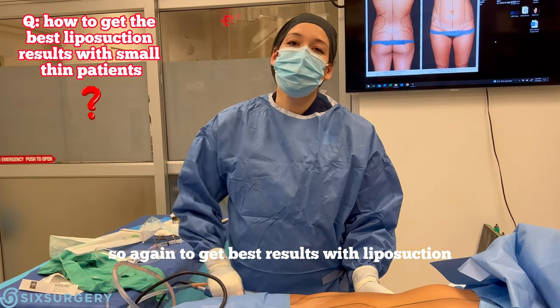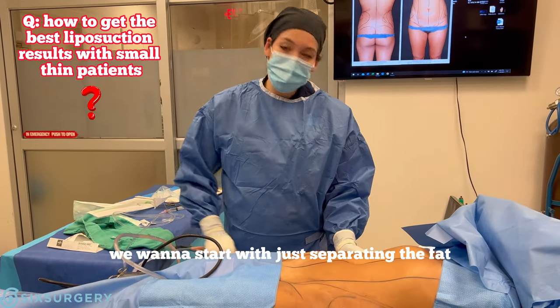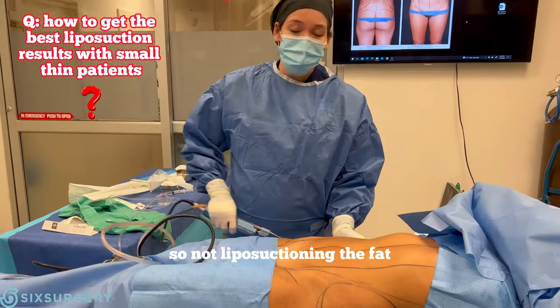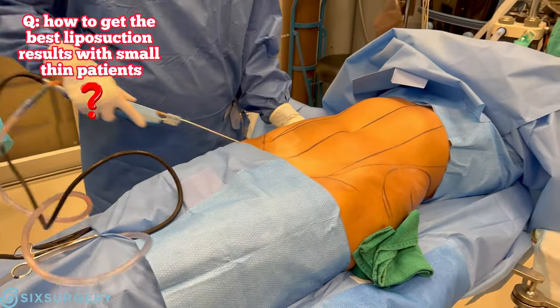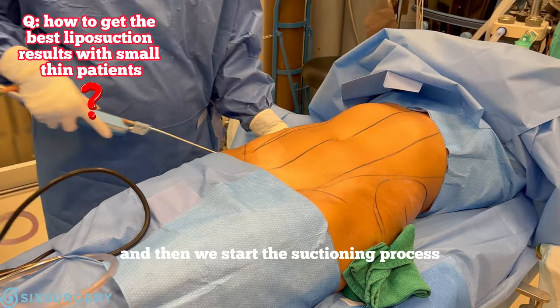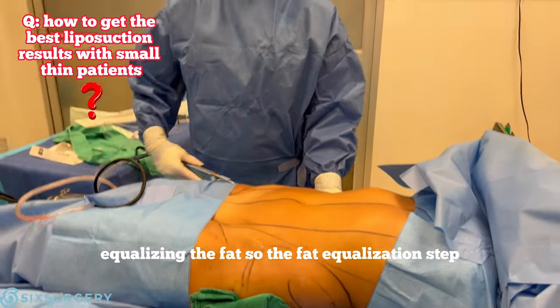To get the best results with liposuction, especially in a small patient, we want to start by just separating the fat — not actually suctioning yet, just breaking it up so it's all even and easy to extract atraumatically. Then we start the suctioning process, which is what I'm doing now.